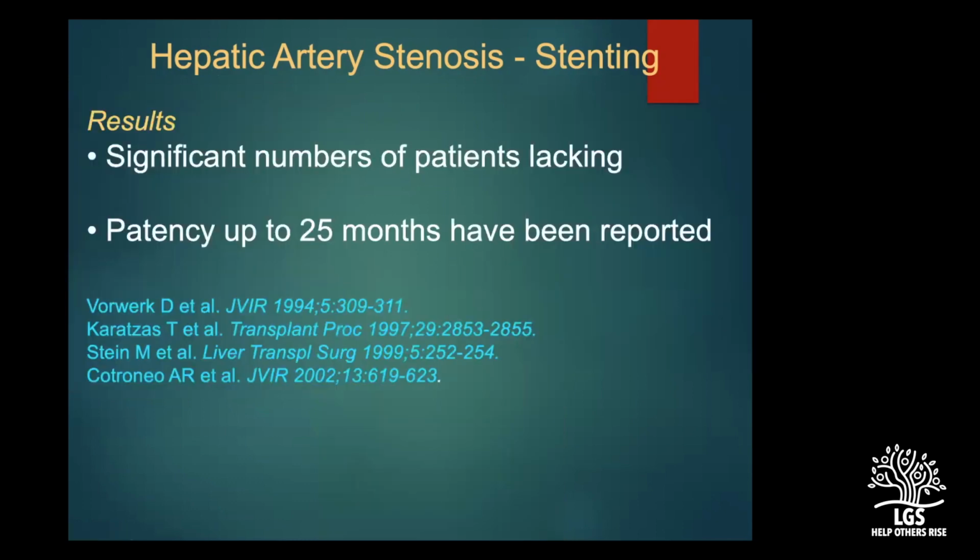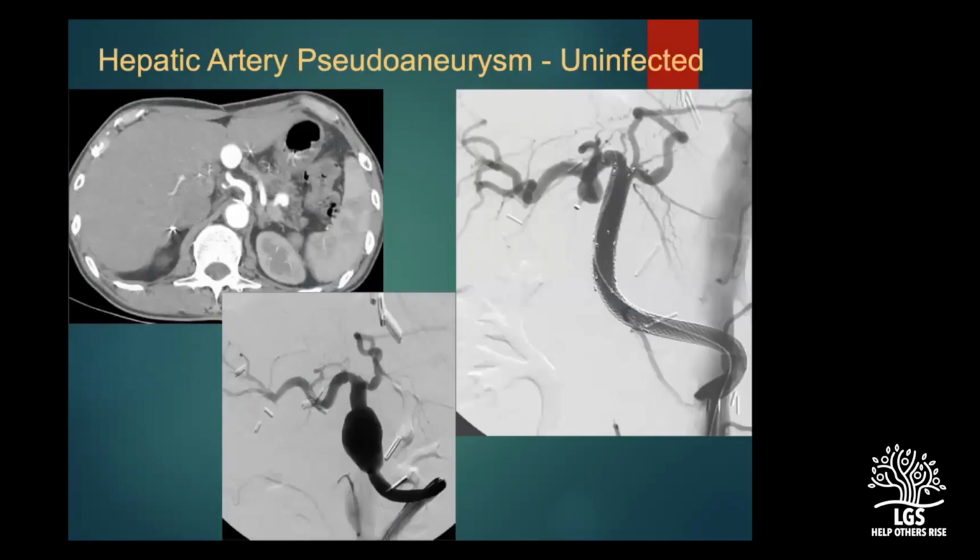So again, the results, we don't have a lot of data, a lot of literature on hepatic artery stenosis, because a significant number of patients are lacking. We don't do this on every single patient, so we don't have enough numbers to really say about the patency rate. But up to 25 months has been reported in that subset of patients who had hepatic artery stenting.